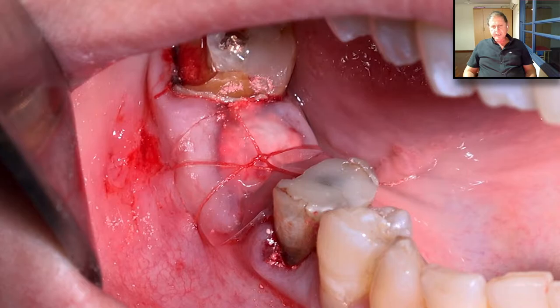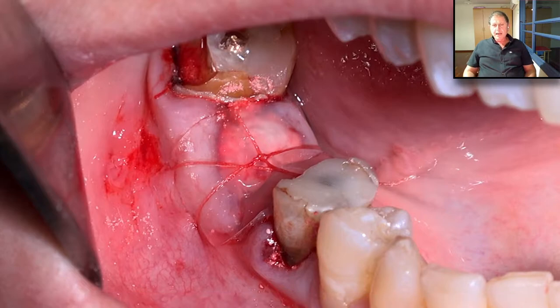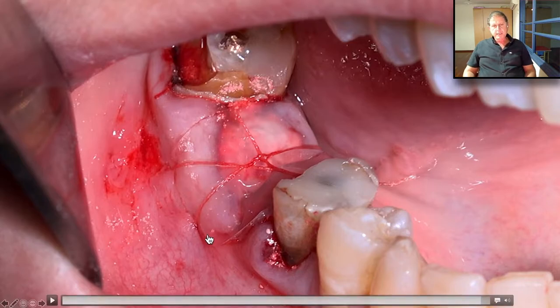In all cases where we do socket grafting and the material is exposed — here it's about 13 to 14 millimeters — we cannot leave it exposed. We must protect it. In the past, we used a lot of collagen sponge. However, the Oraid is much, much, much easier, faster, and gives us even better protection. So this is a very good innovation that comes to help us.